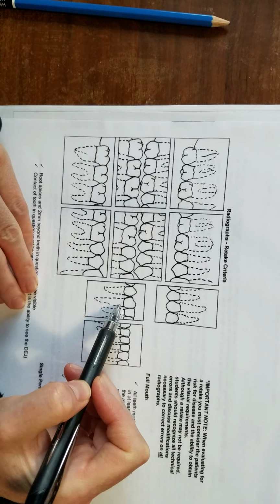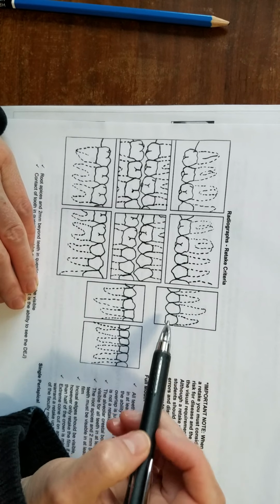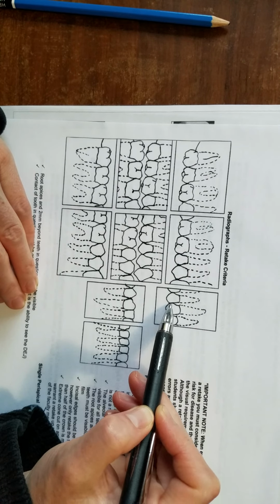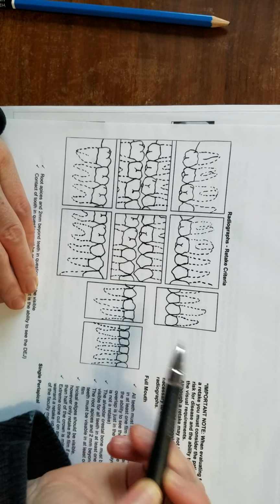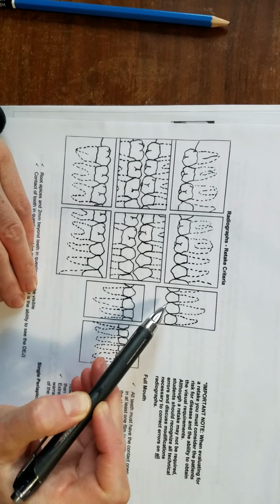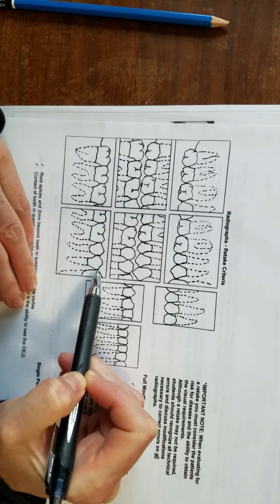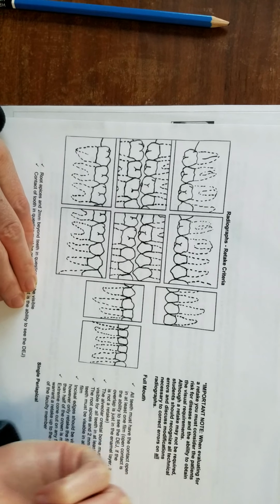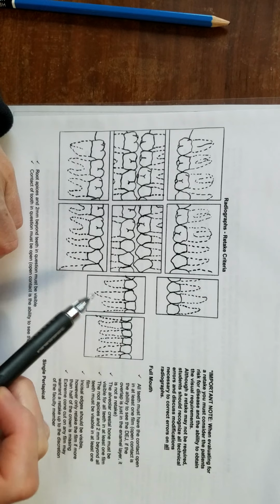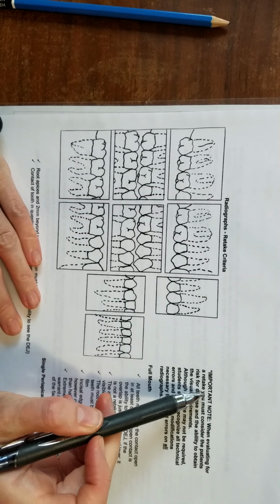Centered canine. And this contact should be open here because very often it's closed in the canine shot because you're taking your picture on a curve. So very often this contact is closed here. So you want it to be open here. And this is just going to take you guys spending time studying these images and understanding what you're seeing. So read these important notes.